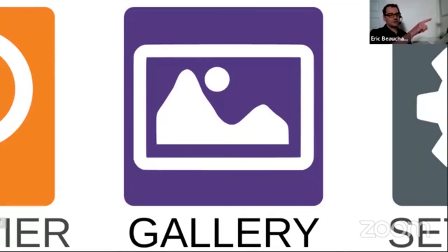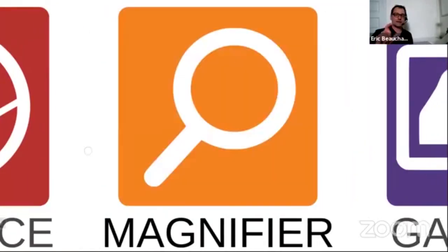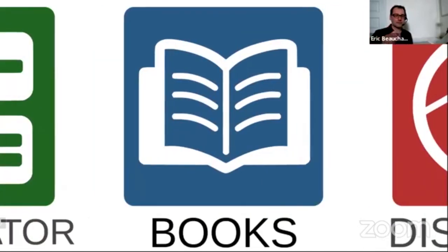So if you just do, I think it's an L, kind of like this on the screen, it's going to pop up with a menu. And in that menu, there's going to be a pause TalkBack. So I'm going to get your email there. I know who just asked that question, and I'll give you some more information through email. Okay. Yeah, I tried it and it doesn't work because I don't have TalkBack on. So yeah, exactly. Okay.